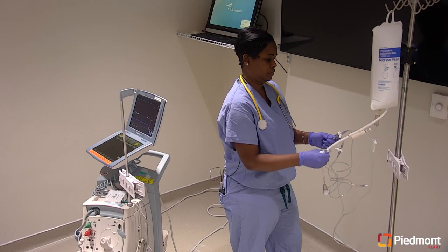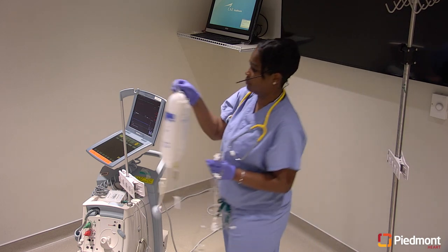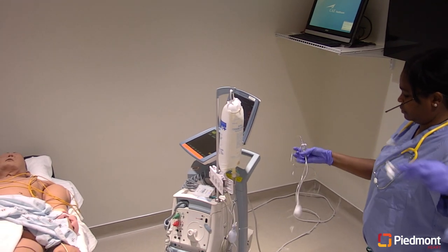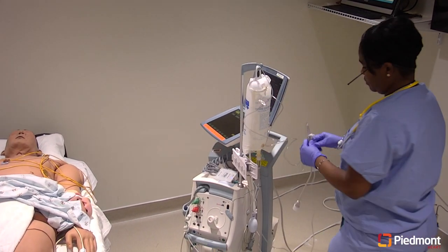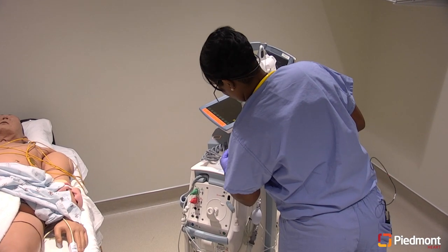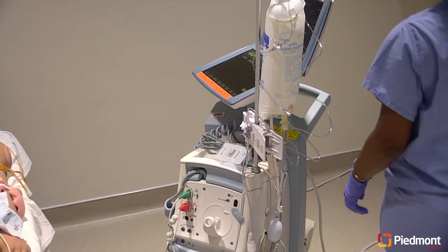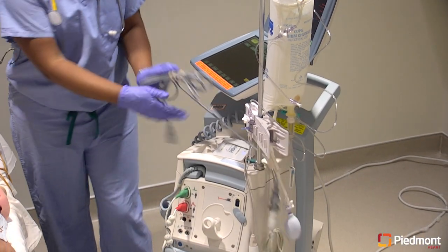Prime and hang a single transducer setup. Untangle the tubing and hang it so that it will be easily accessible when the provider is ready to connect. Then connect the transducer cables between tubing and console.